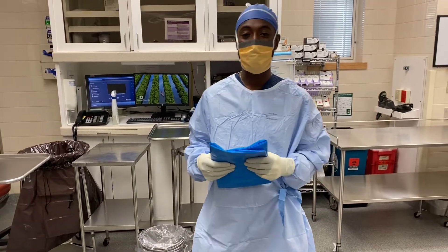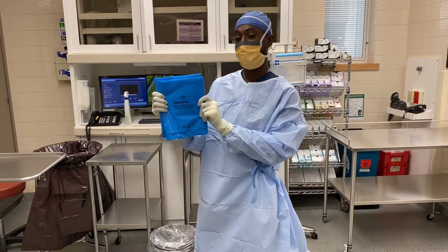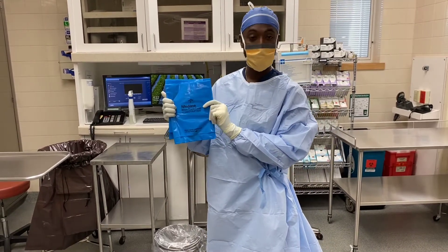What up, what up? This is Surgical Guru and today we're going to show you how to properly drape a mayo stand with a mayo stand cover.